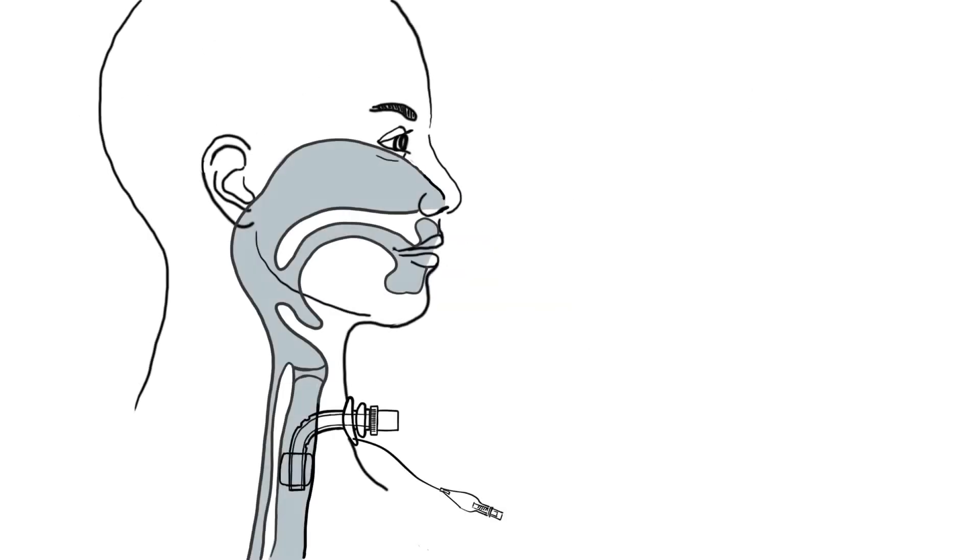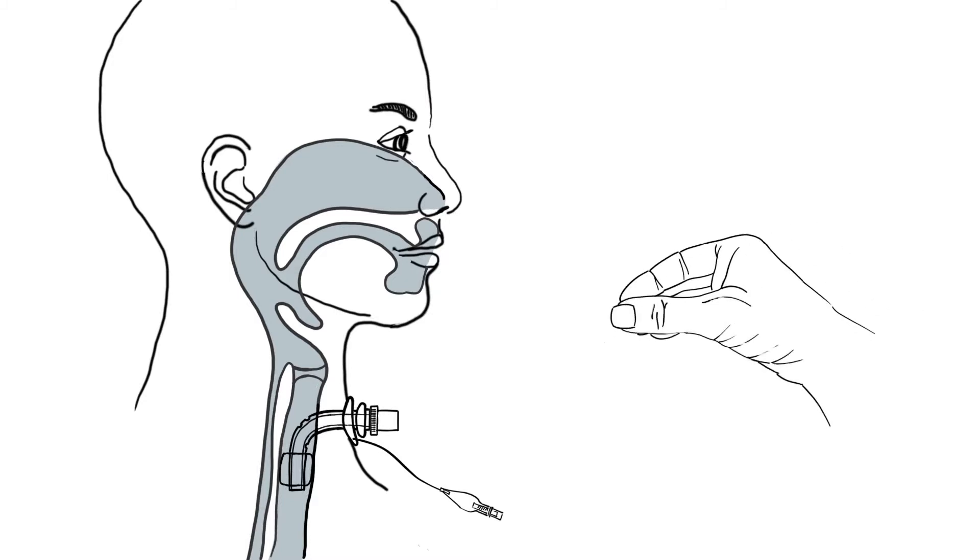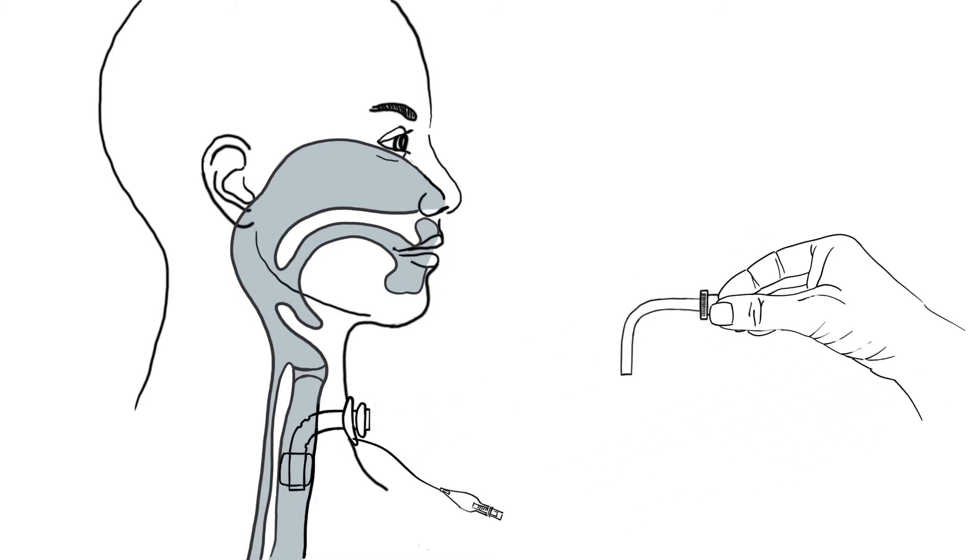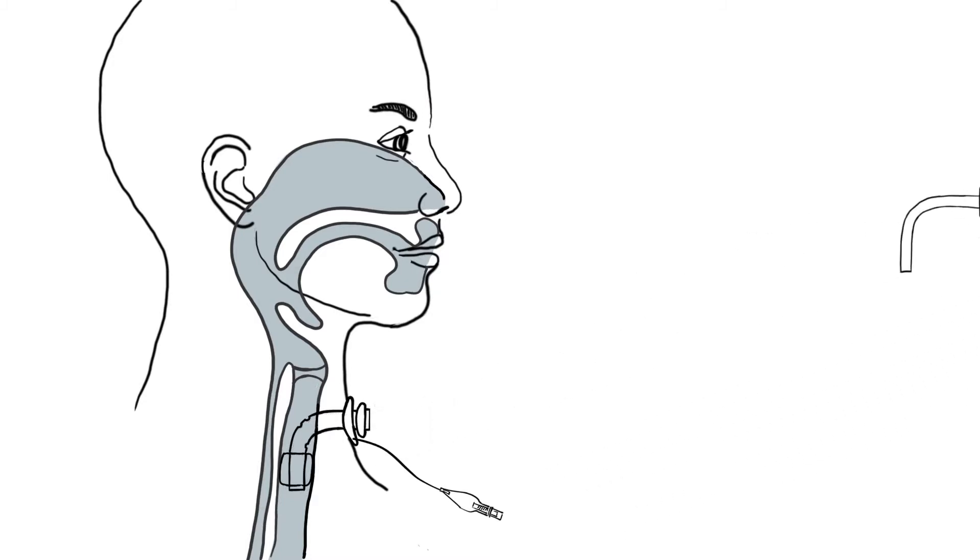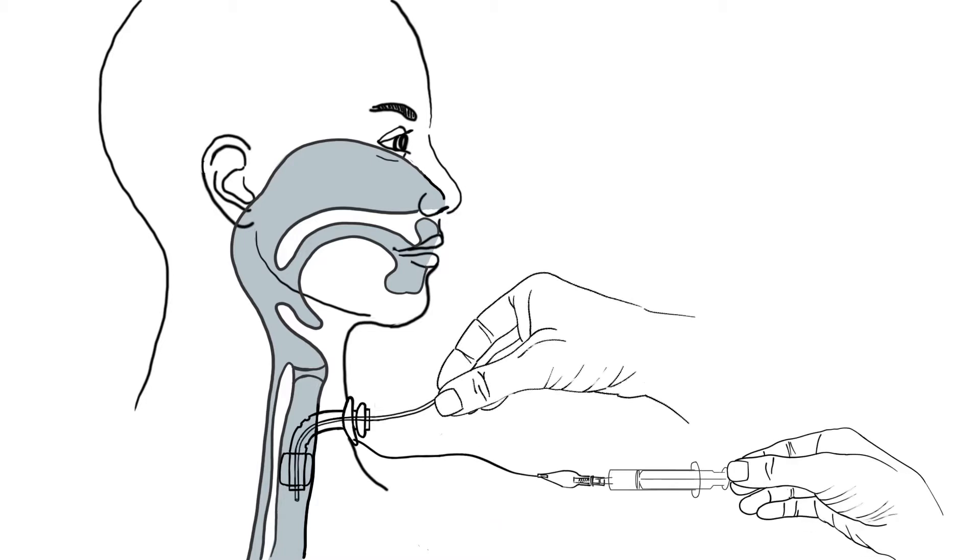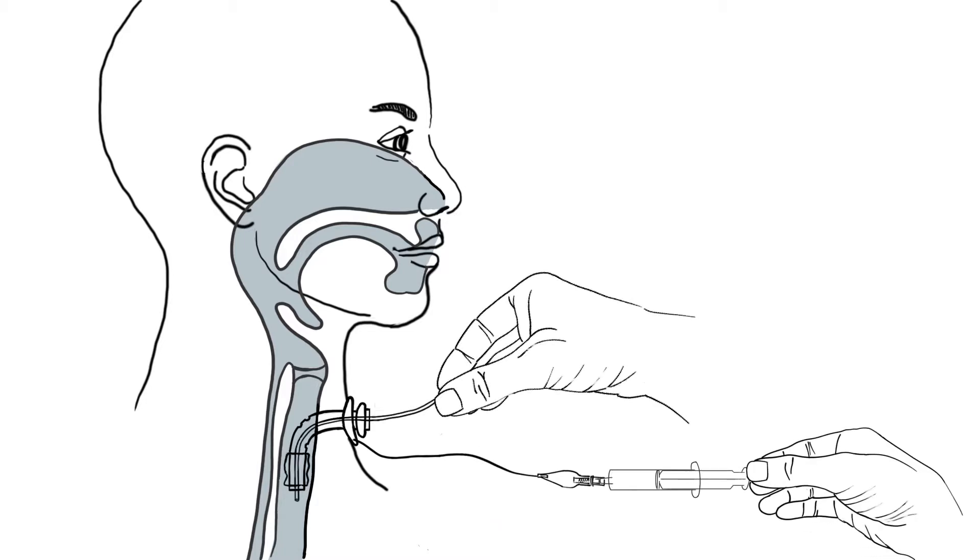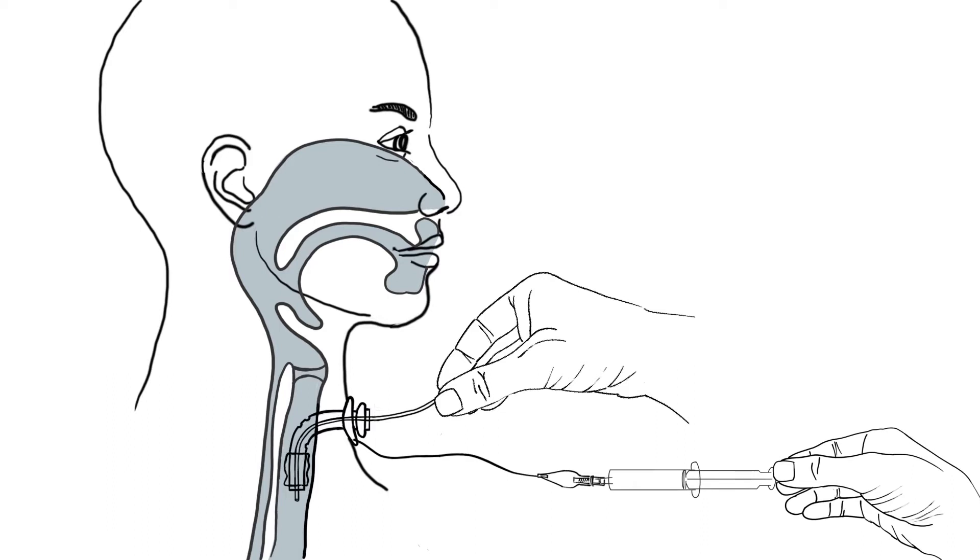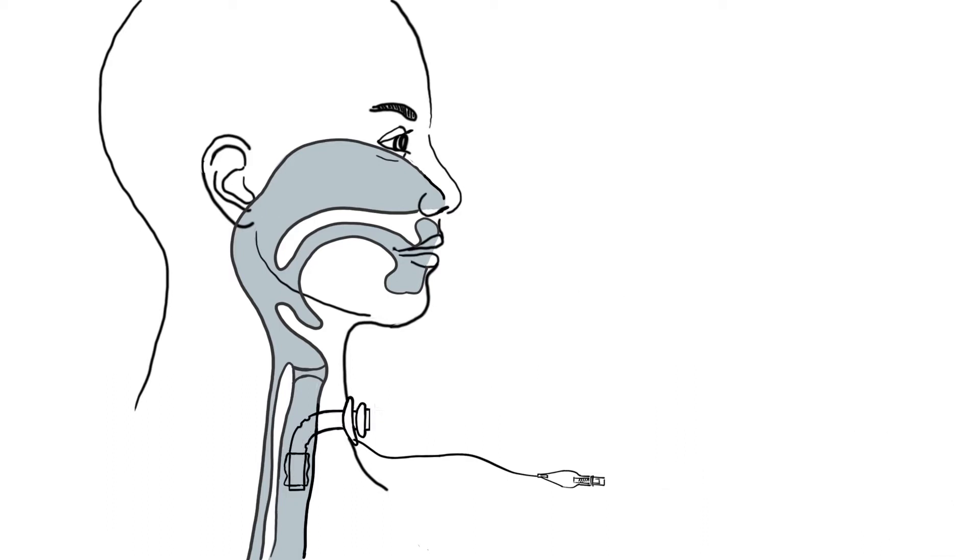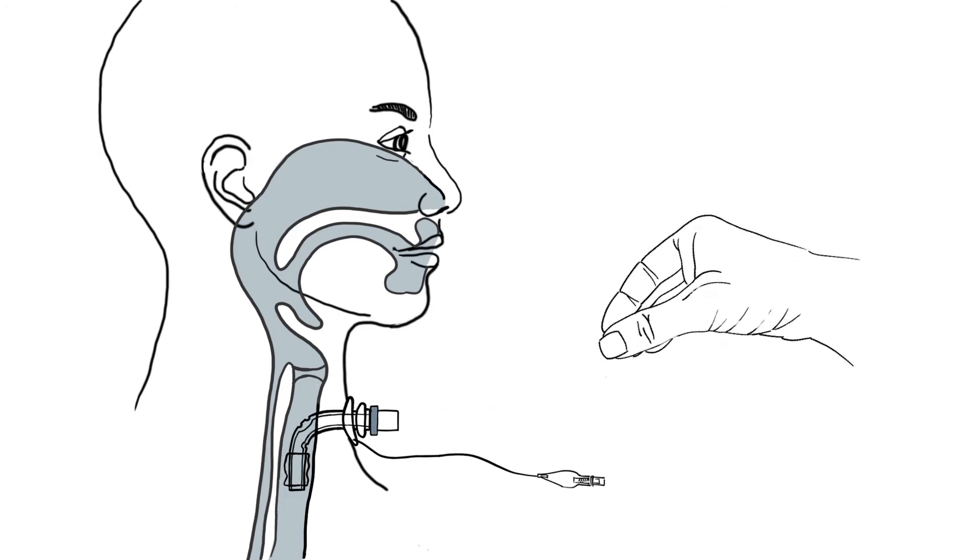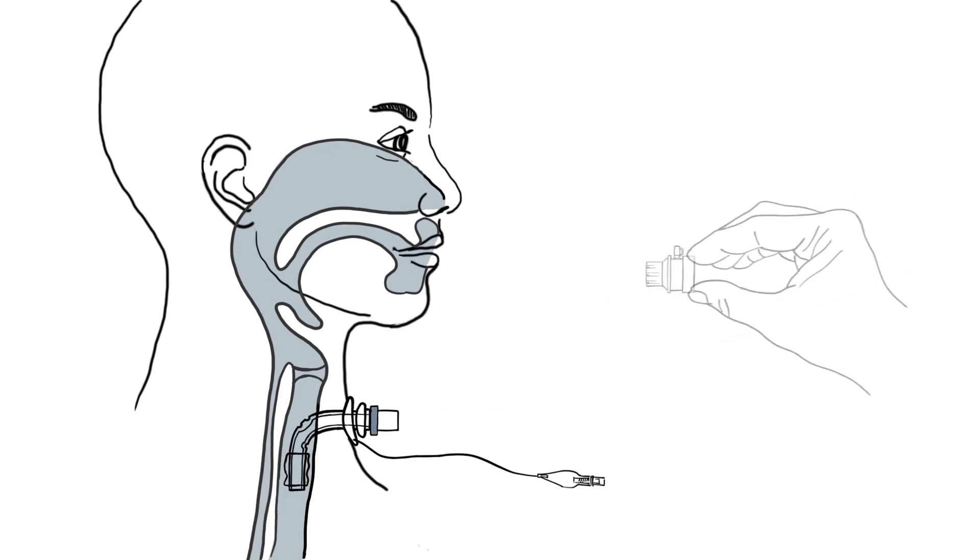The closed inner cannula in place is removed. Then suction while deflating the cuff. Afterwards, insert the fenestrated inner cannula and connect the speaking valve to the 15 mm connector.